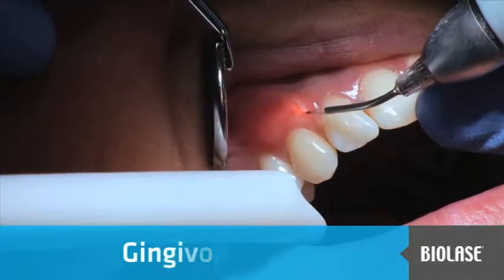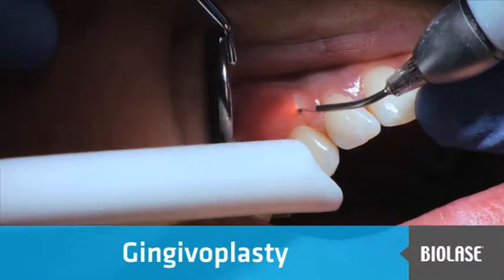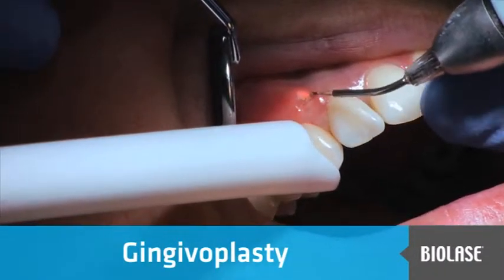This patient had a gingival graft placed in the upper right canine area several years prior. The tissue was thicker compared to tooth number 11, and she was not happy with the bulky appearance.